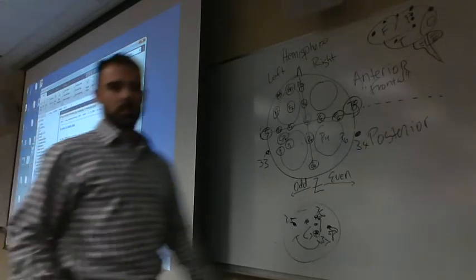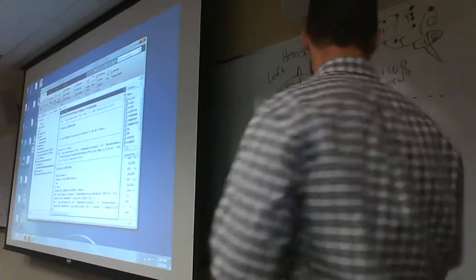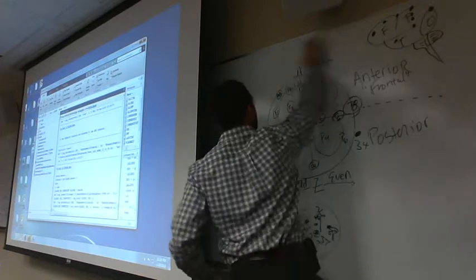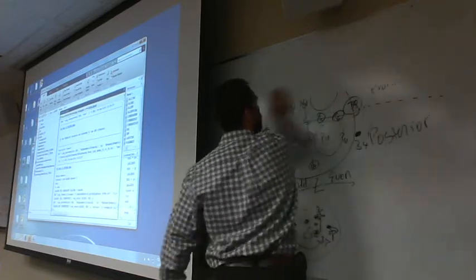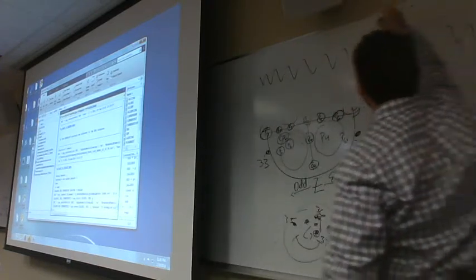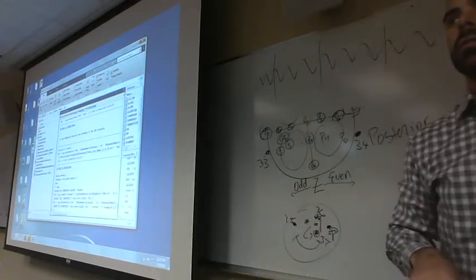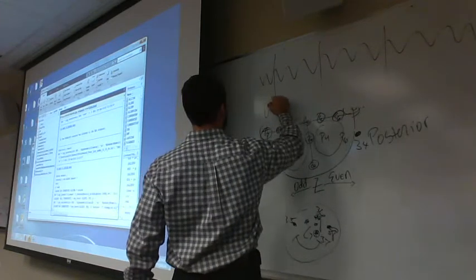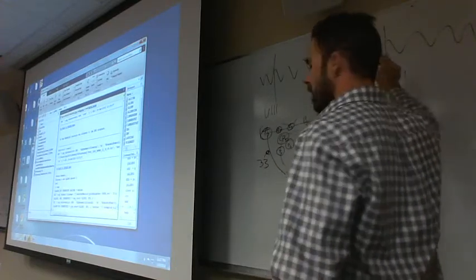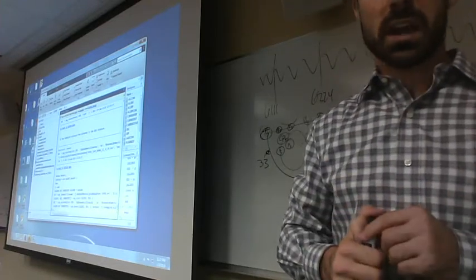All right, let's take a closer look again. Now we have our event list. So what we did is we took our long-running EEG, and every now and then it has events like that, right? That might say 6111, 6324, 6547, and it has all those features in it.